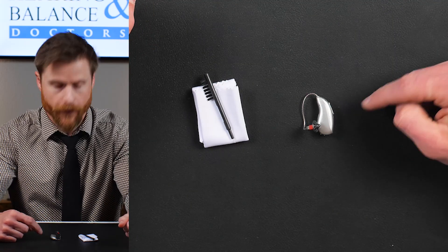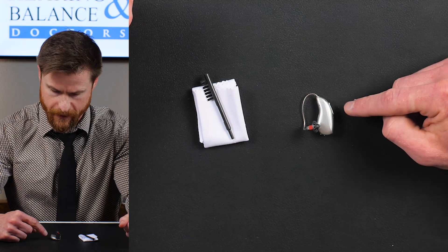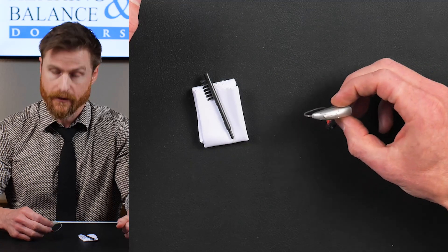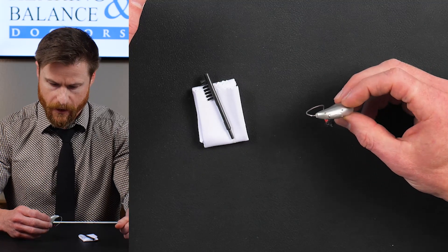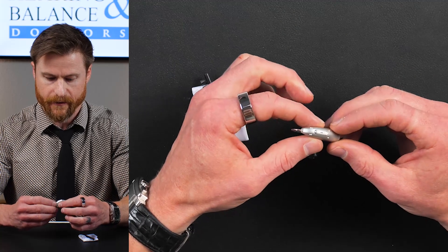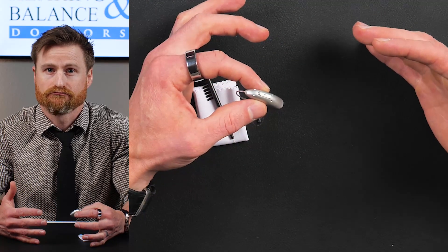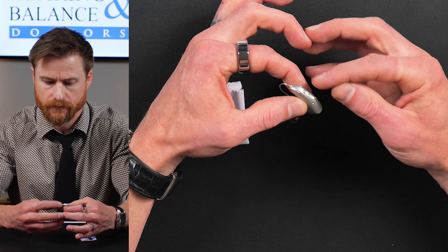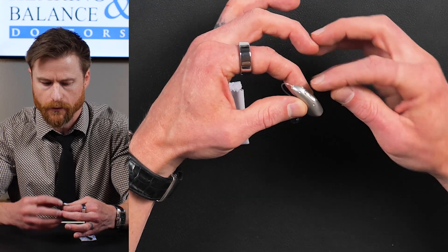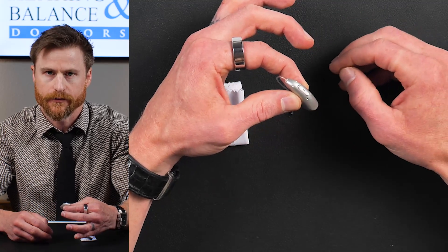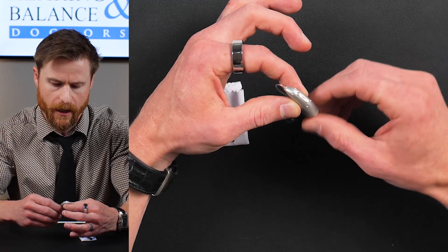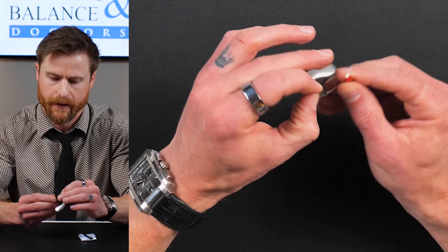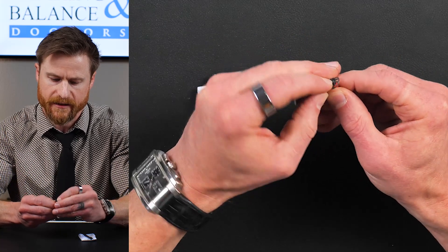Right now I have the Phonak Infineo Sphere device in front of me. This is one I wear often. It's an awesome hearing aid. I love it. So when you're cleaning the hearing aid, there's two main parts that you want to focus on. The microphones. See these like four holes here? Those are the microphone ports. And then the receiver right here, it's the speaker of the hearing aid. So how do you clean this stuff?